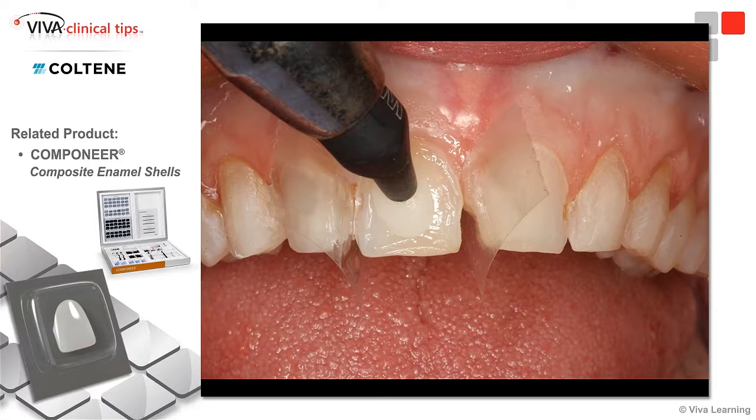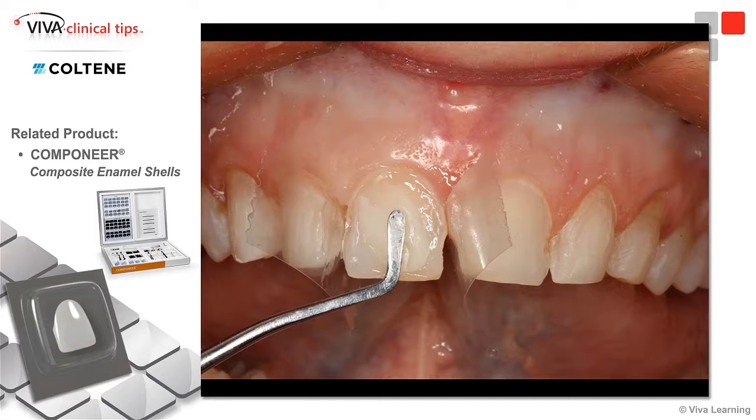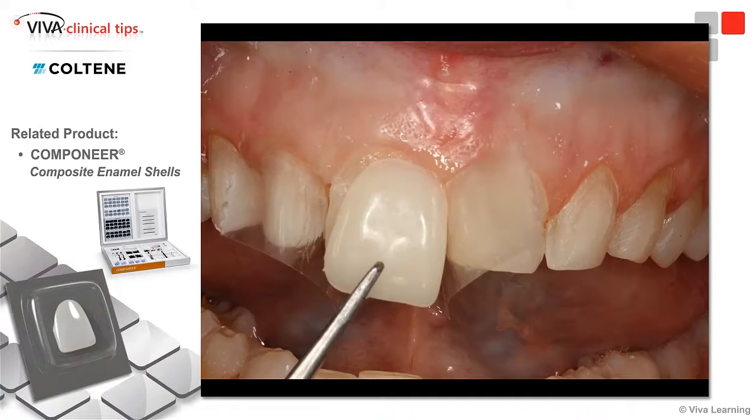And then you also want to place some of your Synergy composite on the tooth itself, because we find that if you don't do that, it's possible that you can get some voids. So you should place a layer of your luting composite on the tooth as well as on the internal surface of the COMPONEER.